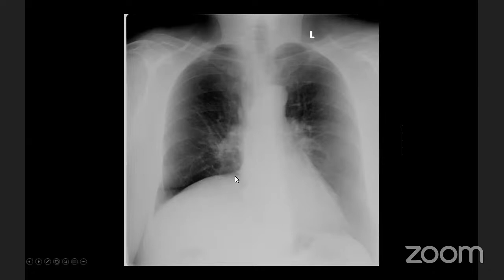If you look at this, the main thing that you mentioned is that the diaphragm is higher. And just imagine, why is the diaphragm higher? It can be because of something happening below the diaphragm or something happening with the phrenic nerve. Those are the two main causes. There is no tumor in this way, and so there can be something happening in here.